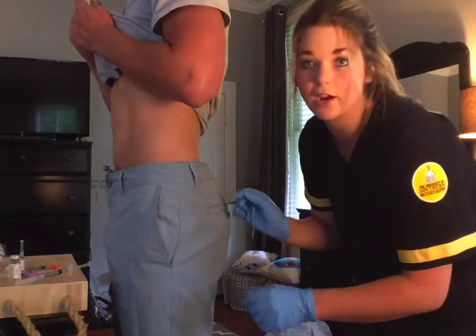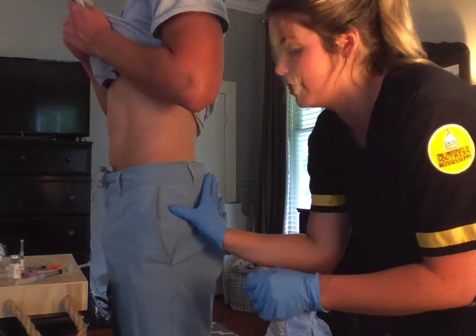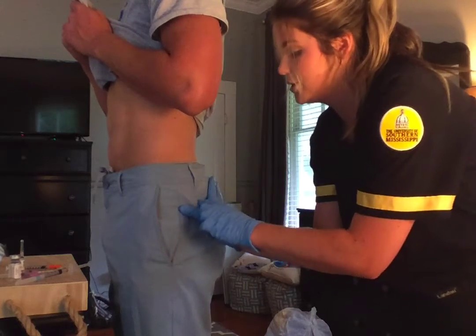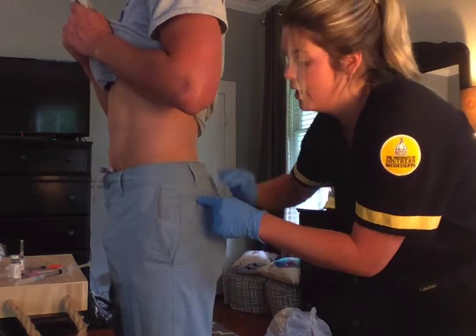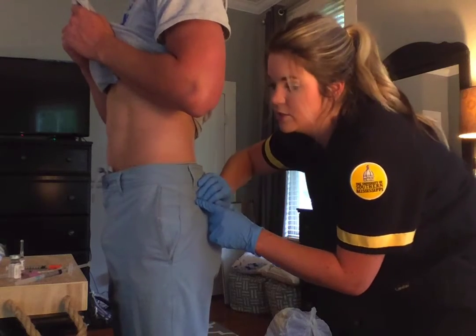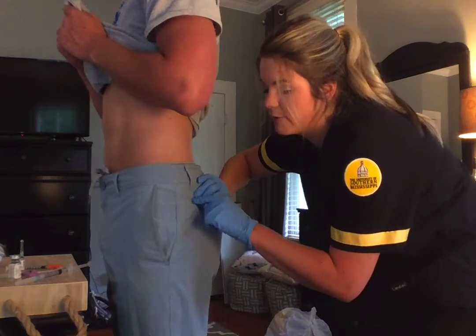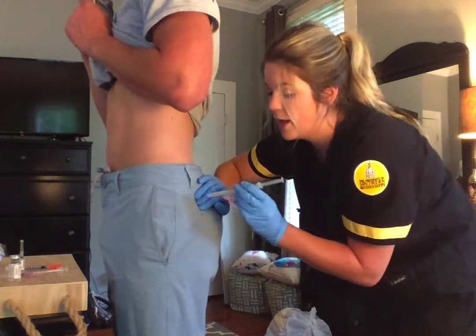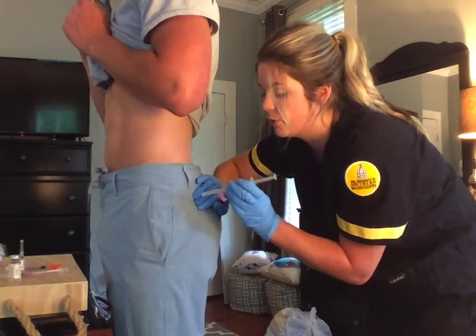I will find the area that I will be giving the shot in. I'll put my thumb towards the iliac crest and my hand towards the top of the bottom. And so I will be giving the shot about this area. I'm going to be using the Z-Track method. So I will be pulling his skin to the side as I give it. And I have my spot right here. I will take my shot that has the cap off of it, and I will put it into the patient on 3. 1, 2, 3.